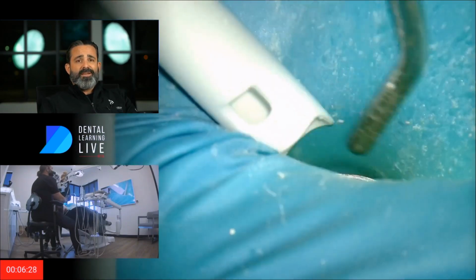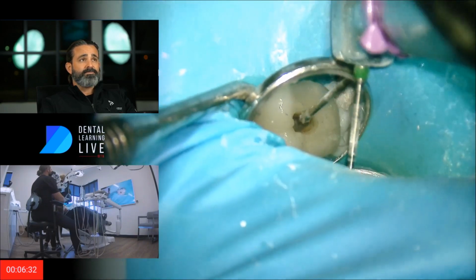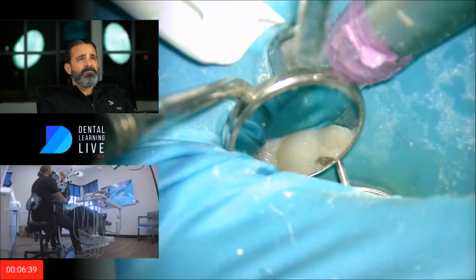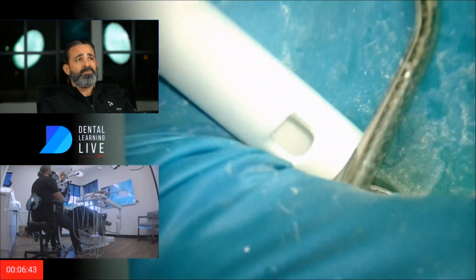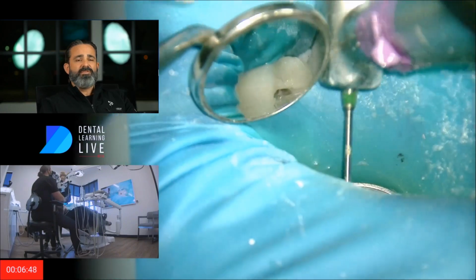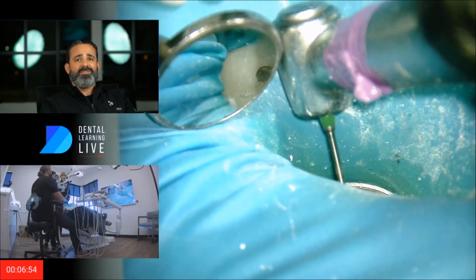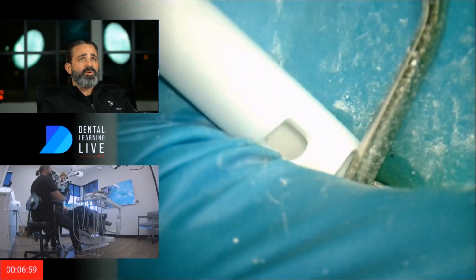And right now I'm just identifying where the orifices are. I really like slow speeds in this. These burrs cut really well, so I can cut through dental material, even amalgam with them. It just gives me the ability to see and feather in on top of it, to make sure I'm not using a high speed and leaning into what I think is the top of a canal when it's not. That would suck, so I don't like that. So I like this instrument a lot for this purpose.